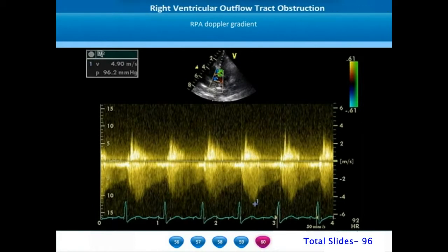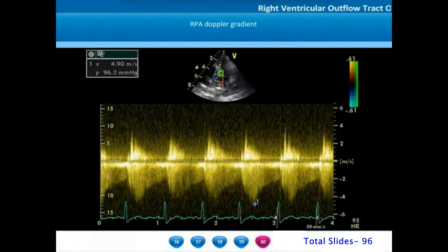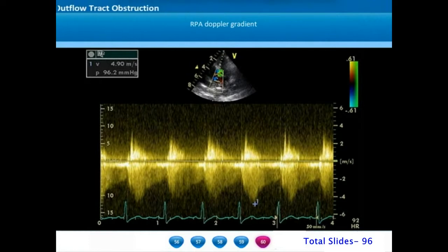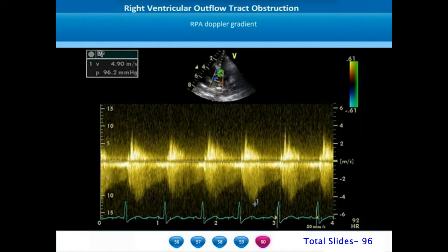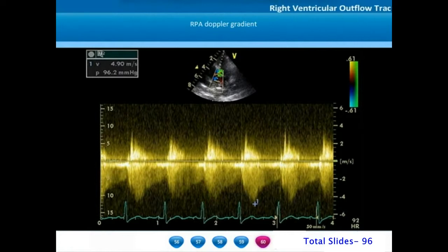On Doppler assessment of the right pulmonary artery gradient, we notice a peak systolic pressure of 96 mm of mercury. Whenever a patient with unilateral pulmonary artery stenosis has a gradient of more than 50 mm of mercury, it indicates that there is also a distal narrowing in the contralateral pulmonary artery. With unilateral pulmonary artery stenosis, there is complete redistribution of pulmonary blood flow into the other lung, so there will never be marked elevation of proximal main pulmonary artery and right ventricular systolic pressures. A gradient exceeding 50 mm of mercury is a clear indicator that pulmonary arteries on both sides are significantly narrowed.